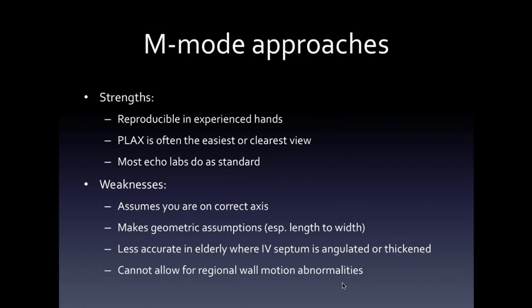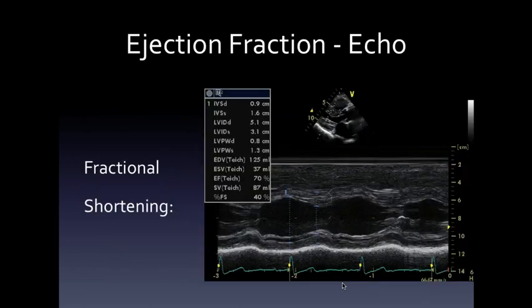So this is a recent case. These are all cases that I looked at recently, just to make it as real as I could. And this is the best I could do at measuring the left ventricular ejection fraction. The packages are standard nowadays. What you're looking at here, you're going to measure the left ventricular internal diameter. So that's this here in diastole. And you're going to time that, of course, to the electrical signal that is the QRS, and then you're going to take it in systole.